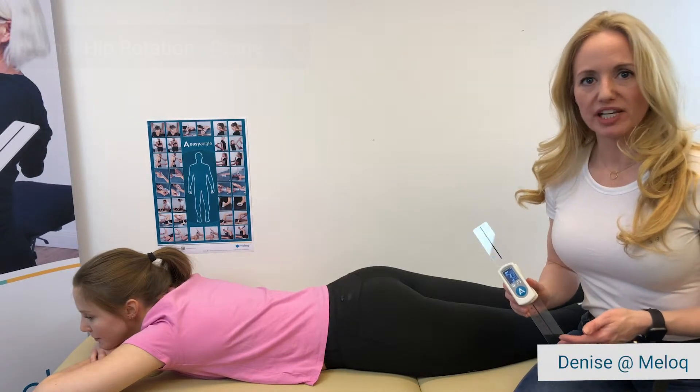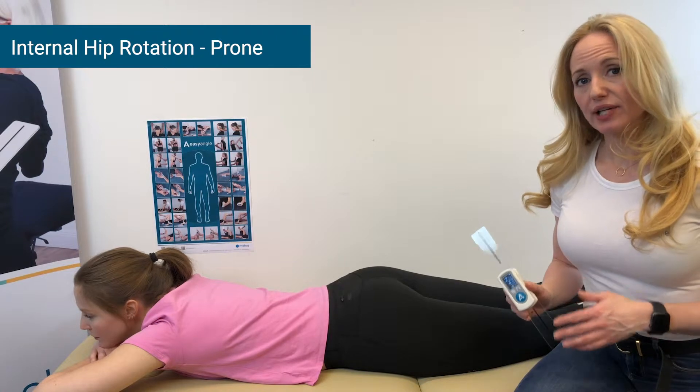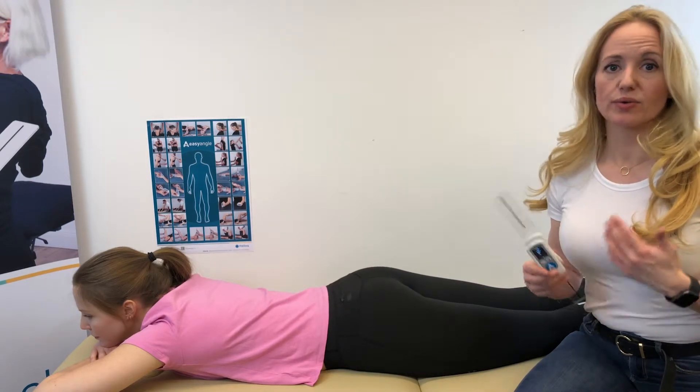In this easy angle measurement video, we are going to demonstrate how to measure internal hip rotation in the prone position. We start by pressing the button to get the blinking zeros, which lets us know that we're ready.